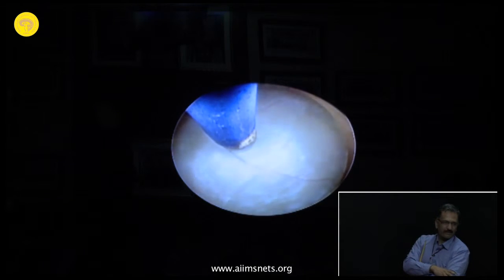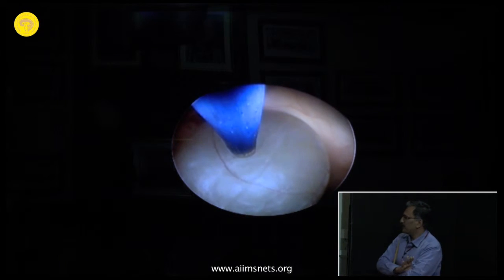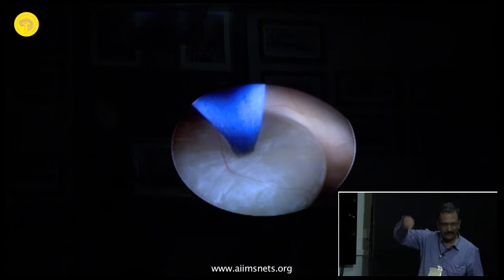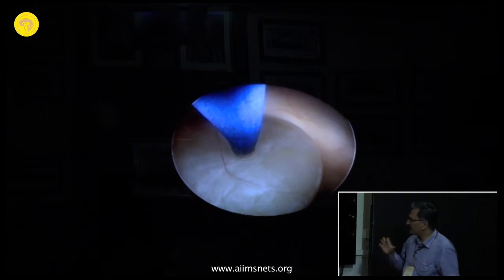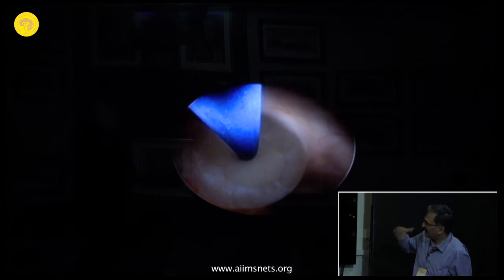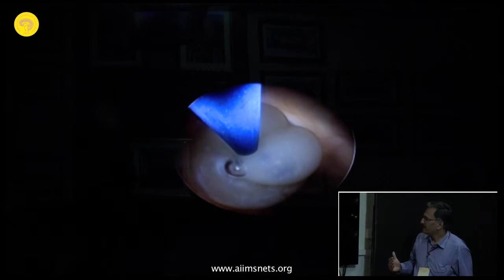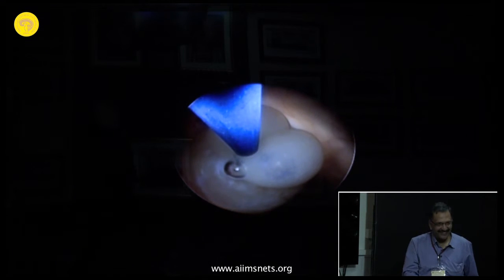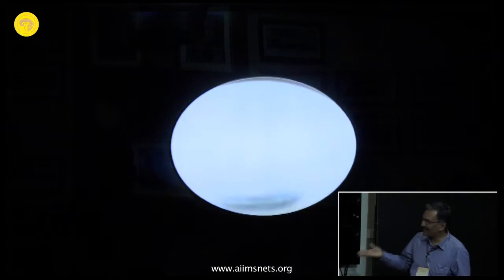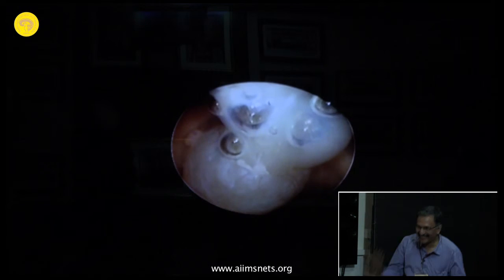So here, the membrane is very, very thick. What you need to do with monopolar is make several fenestrations there. Even with that, it's very difficult, and then comes the problem. The secretion is so thick that it's not even flowing out. You see, it's hanging there. It's not even flowing out.